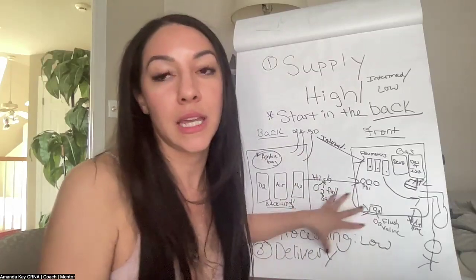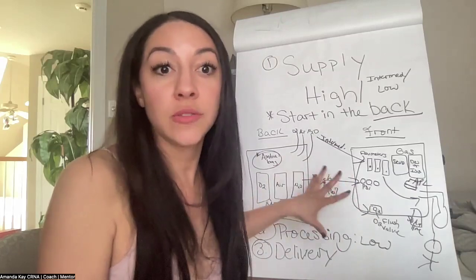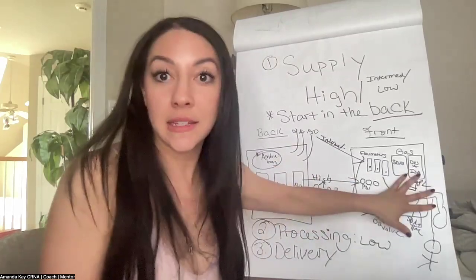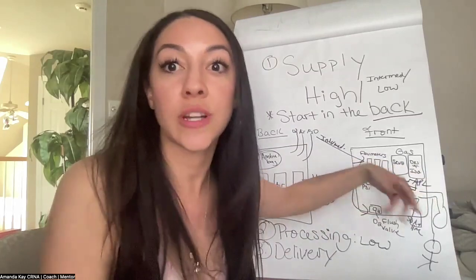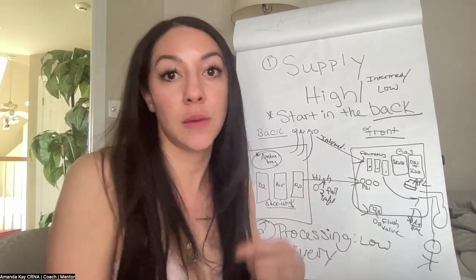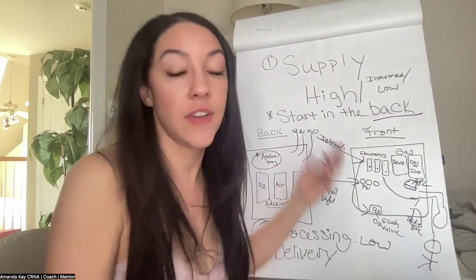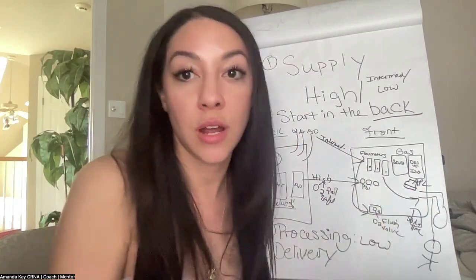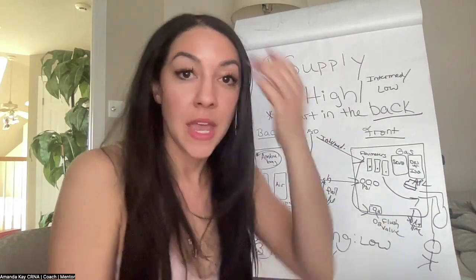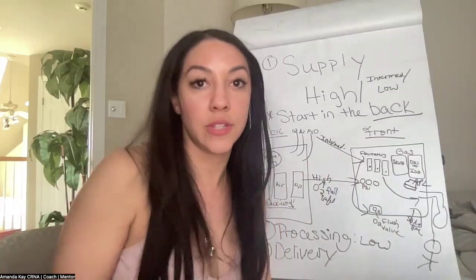But these are basically your circuit systems that you use daily. What this is, essentially, is a semi-closed or circle system. When we're doing MAC anesthesia and we have the patient hooked up to the auxiliary oxygen hookup with a face mask or nasal cannula, that is more of an open system.